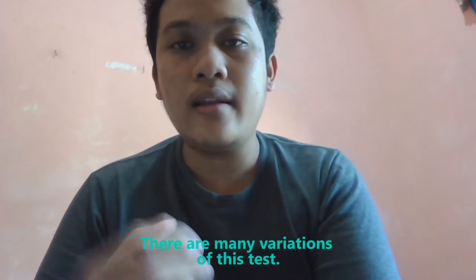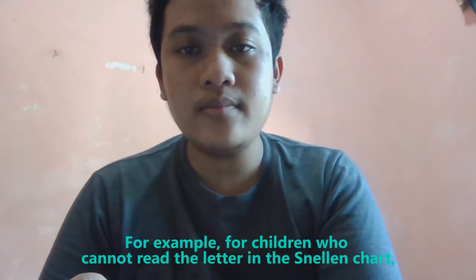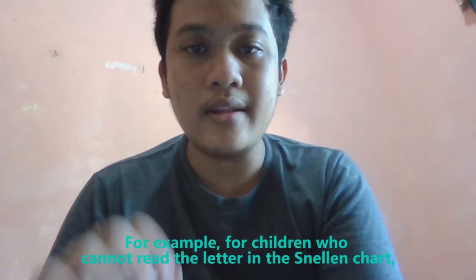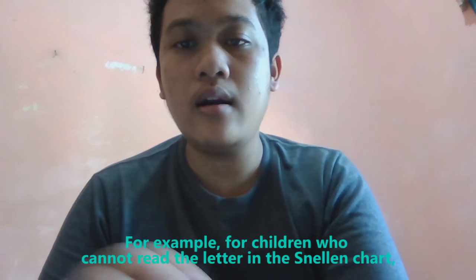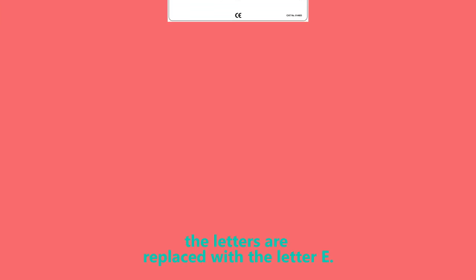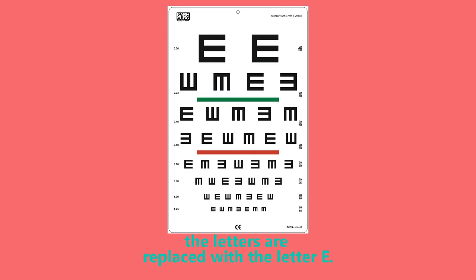There are many variations of this test. For example, for children who cannot read the letters in the Snellen chart, the letters are replaced with the letter E. Subjects are asked to say where the letter E opens. This modified chart is also called a tumbling E chart.